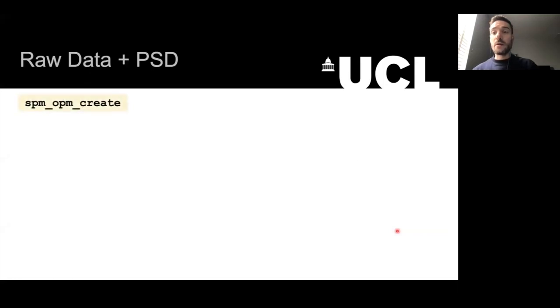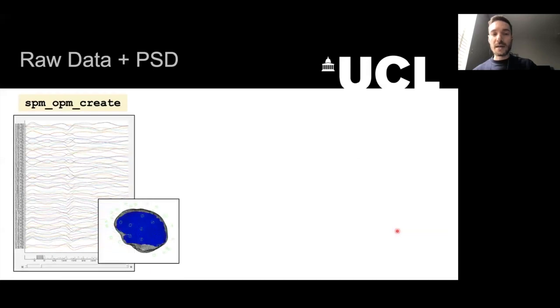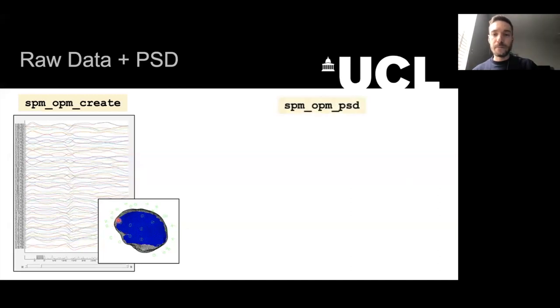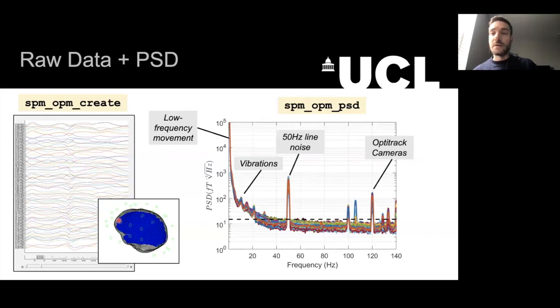We load in the raw data from this experiment using SPM OPM create. It looks quite noisy with a lot of low frequency interference, as the person is making continuous movements around the magnetically shielded room. SPM performs the co-registration for us — you can see sensors all around the head, including over either side of the auditory cortex. Plotting the power spectral density using SPM OPM PSD, we can see many sources of interference: low frequency artifacts from movement, vibrations in the MSR, 50 Hz line noise, and artifacts from the OptiTrack cameras.